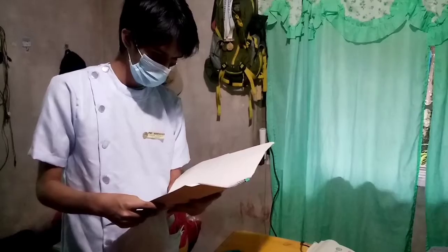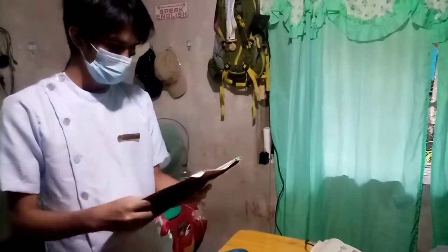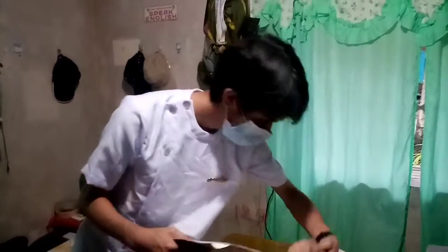Identify the patient by checking the name and identification on the patient's identification band, or ask the patient to state his or her name. Okay, sir, you are Raymart.